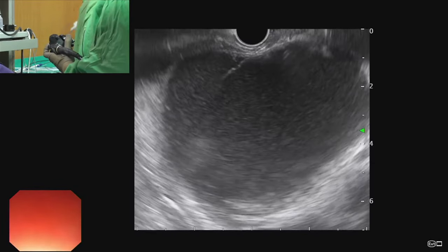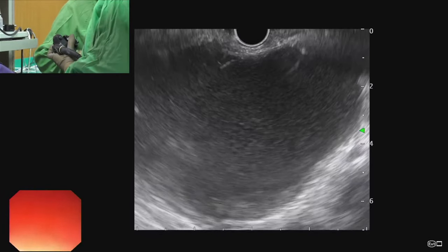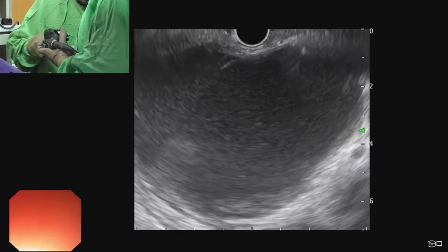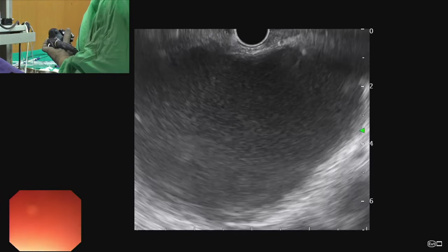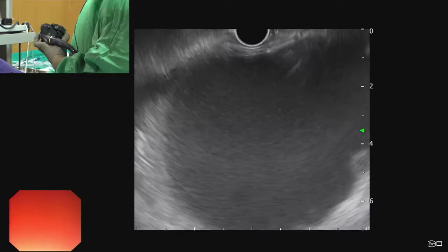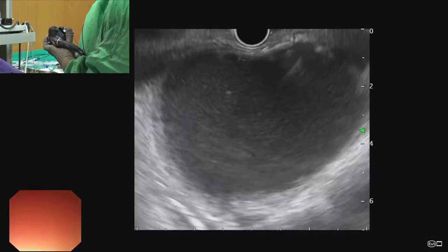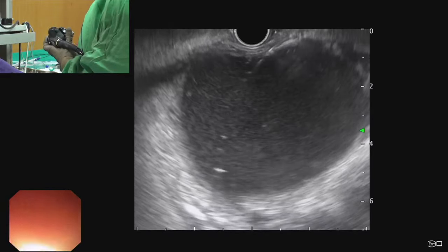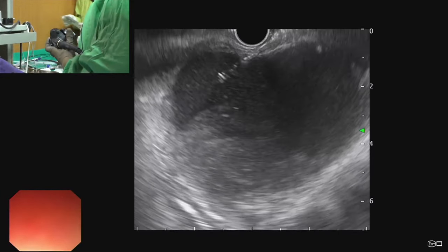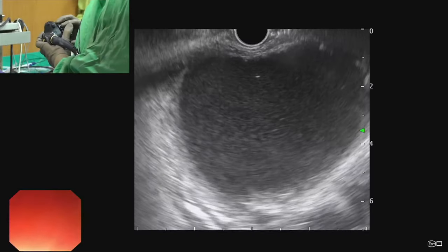Once the balloon is inside, we compare it to the wire — the CRE balloon catheter is a sturdier catheter. Once we have the CRE balloon catheter inside the fluid collection, we can move slightly away from the gastric wall to get endoscopic vision. Over a bare wire, moving away risks the wire coming out, but the balloon catheter is a thicker accessory. Under endoscopic vision, we can see the balloon going inside the walled-off necrosis.